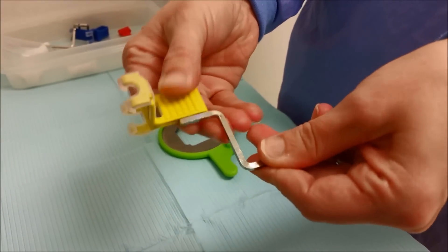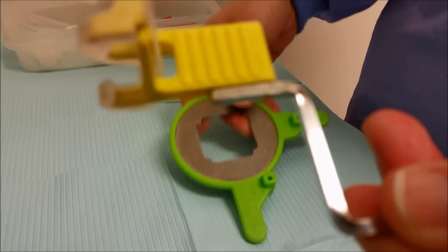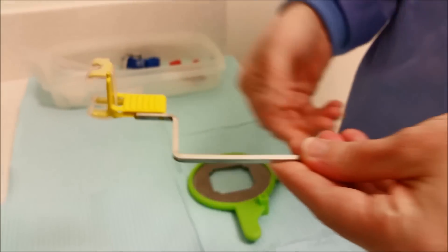I'm going to slide in the pegs into the bite block like so.